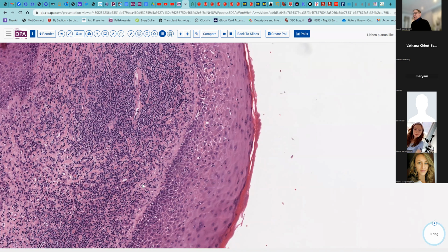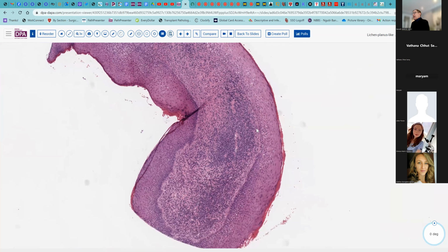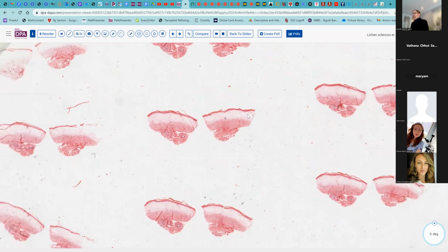Not a very common disorder to encounter in the vagina, but in someone with that history, it would certainly be a great coup for you to be able to make that diagnosis. And finally, the other lichenoid dermatitis that can involve the vulva and vagina. You can make this diagnosis at low magnification. You can just see the pallor here.